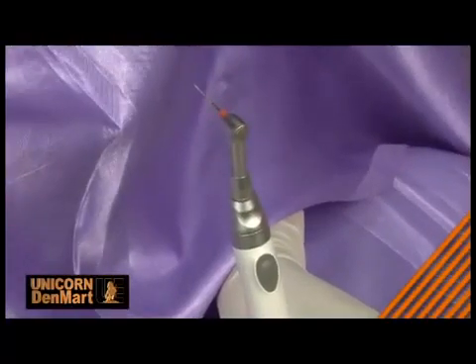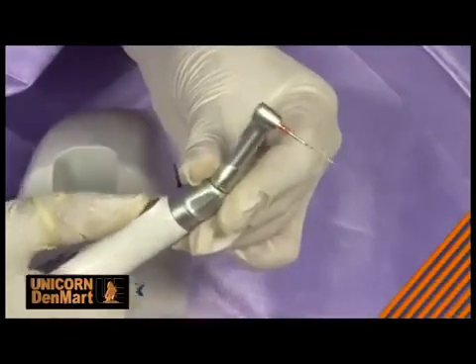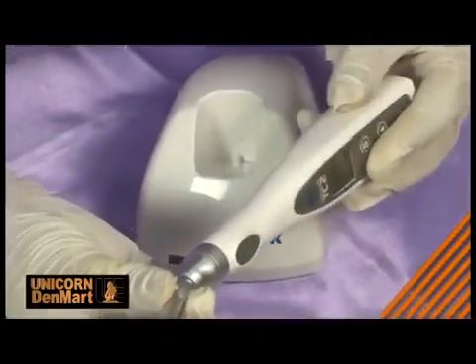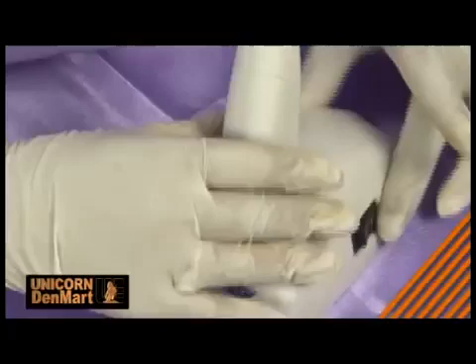Endomate is the only micromotor with torque control and autoreverse function. The autoreverse function is activated when the micromotor overloads against the preset fine torque. The motor reverts to forward rotation after autoreverse has been freed. It has 5 inbuilt settings delivering smooth and powerful torque as per the needs.